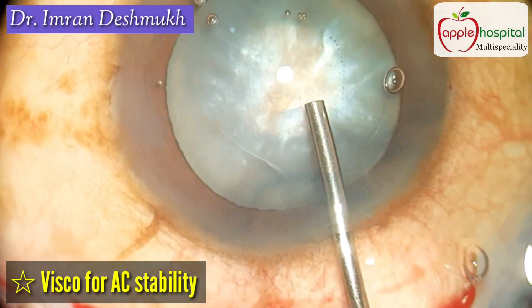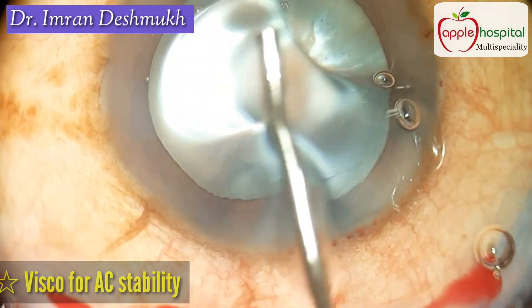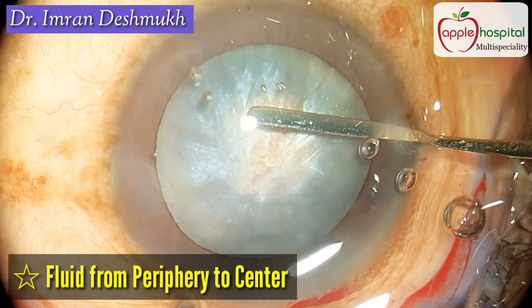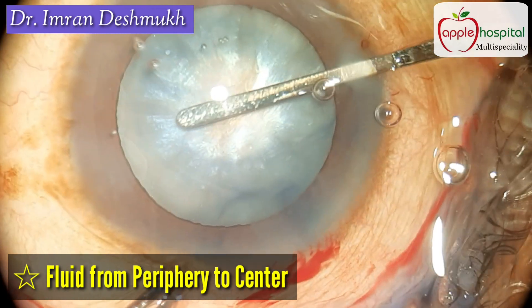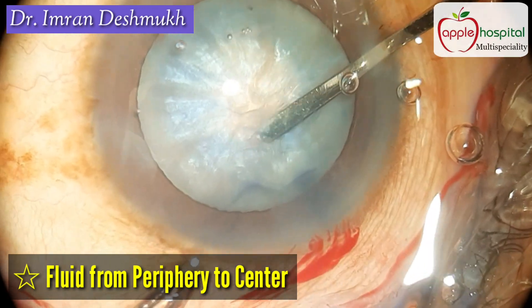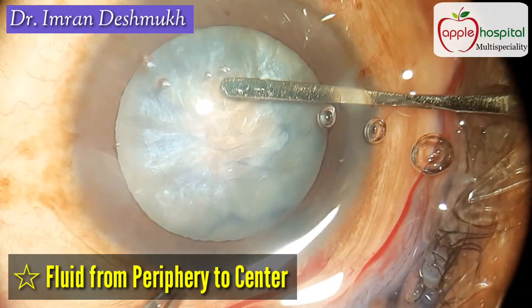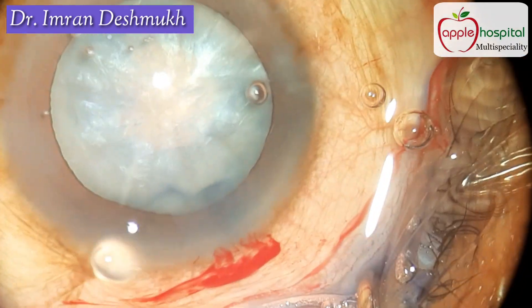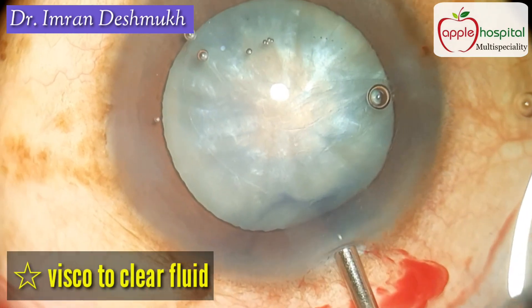Once you have done that step, use viscoelastic to maintain anterior chamber stability and to clear the media. After that, bring in your iris repositor and sweep from periphery to center so that the excess fluid from the periphery comes out to the central opening. This will help you do your rhexis really easily.